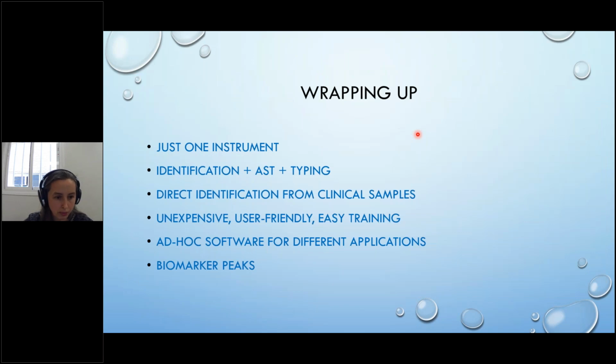And just to wrap up, I want to summarize that it's important to have one instrument in which you can perform these many different applications. So one MALDI-TOF for identification, AST, and ideally also for bacterial typing. So you can more or less apply these three applications in a standardized way. Probably there will be more in the future.